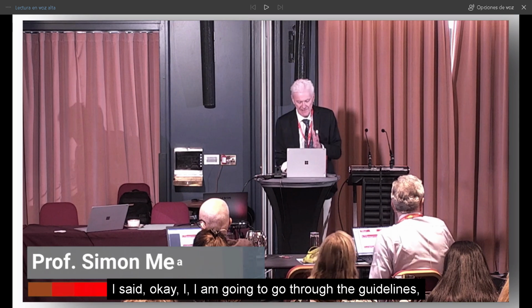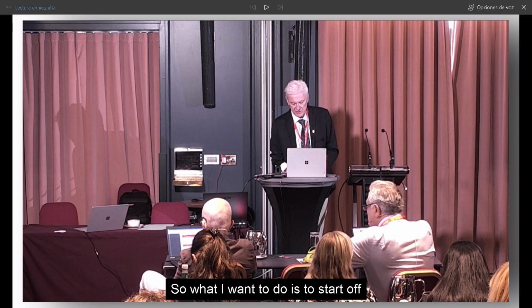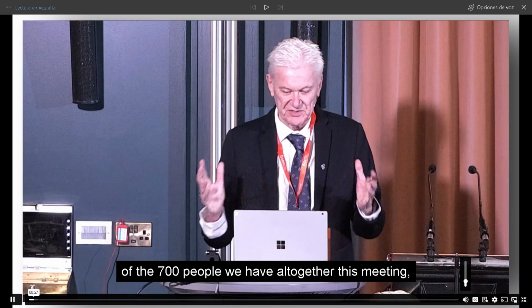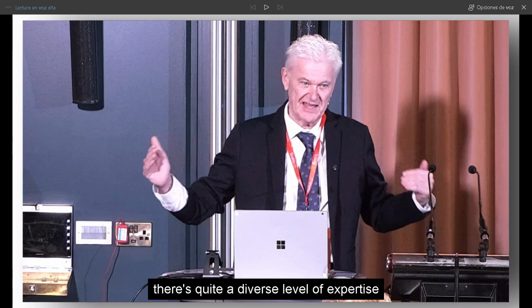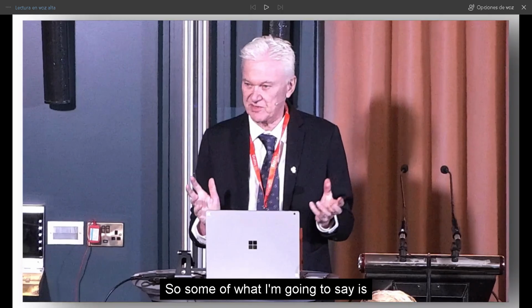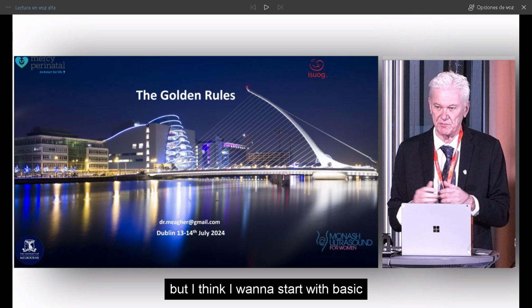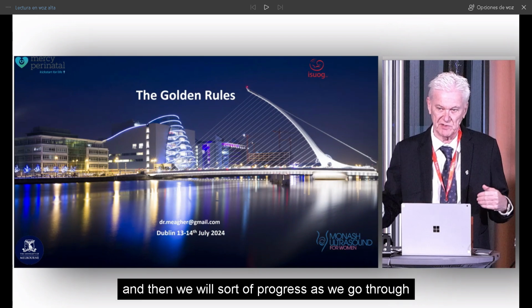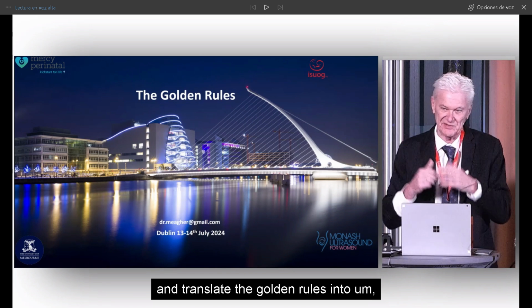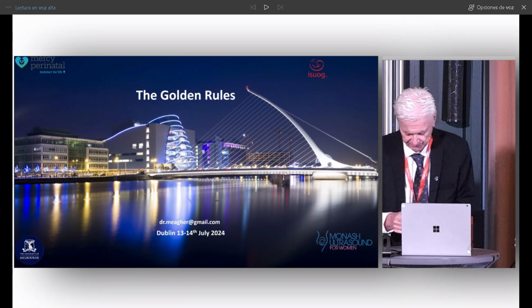I said, okay, I am going to go through the guidelines, but I'm going to do it in a different way. Of the 700 people we have altogether at this meeting, there's quite a diverse level of expertise amongst those present. So some of what I'm going to say is absolutely basic. But I want to start with basic, and then we will progress as we go through, and then hopefully I'll translate the golden rules into live scanning in a second. Just let me start my watch.